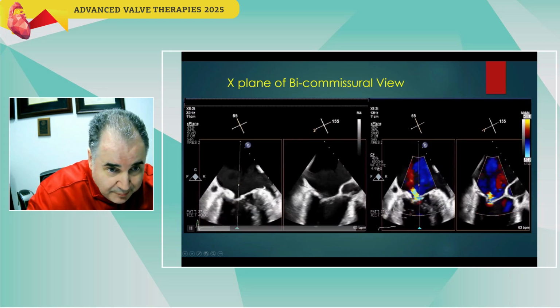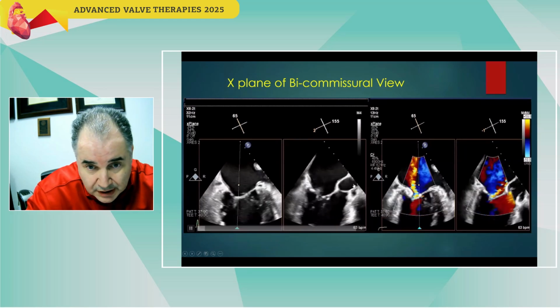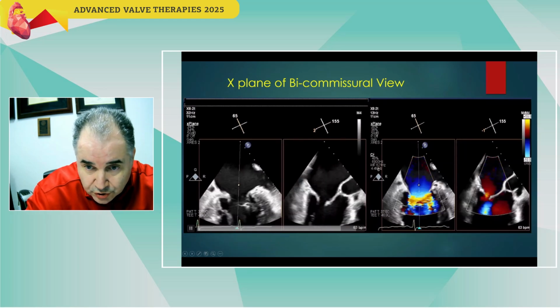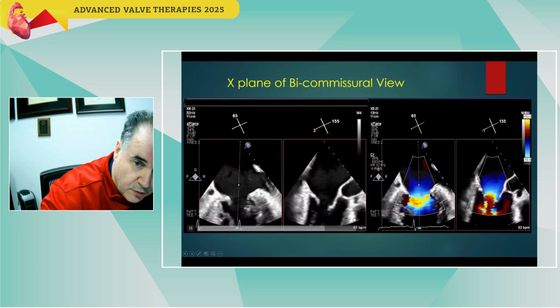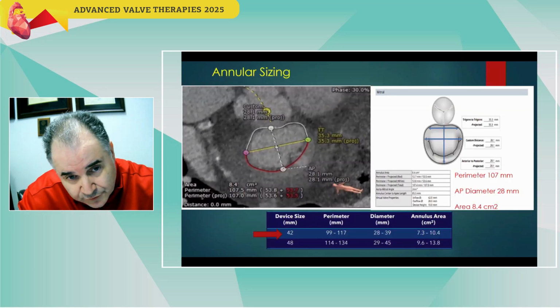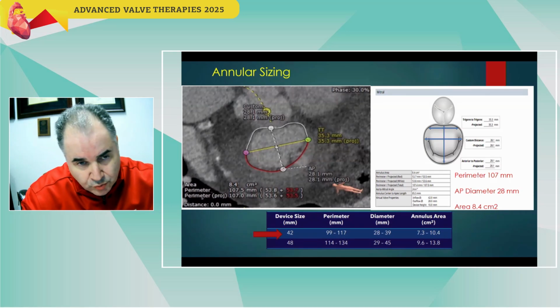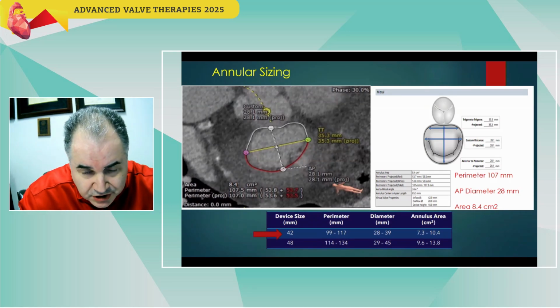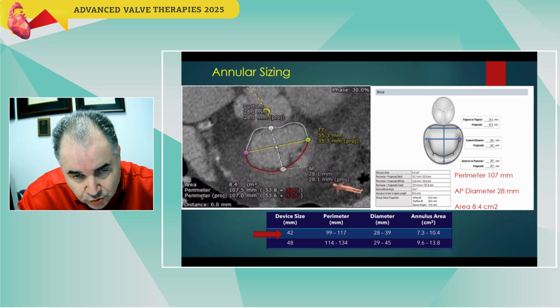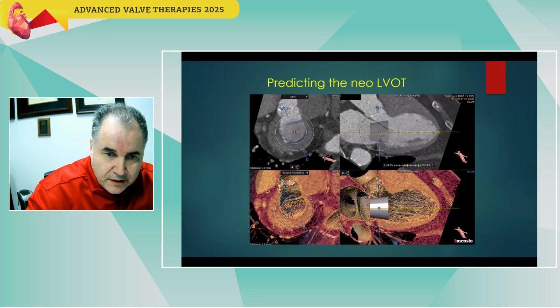This is again the lateral part of the apparatus, the medial part of the apparatus, aortic valve, anterior, posterior, severe mitral regurgitation in this patient, high risk, CT critical. And we have, of course, today with 3D echo technology, the ability to measure the annulus. We do this all the time in order to compare the techniques, but CT is very critical to measure the area of the annulus and decide what size of valve will be used.